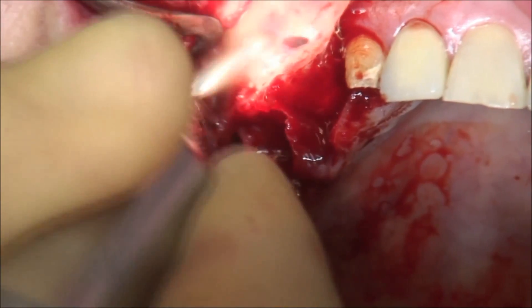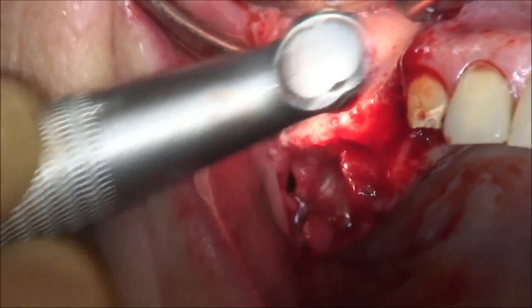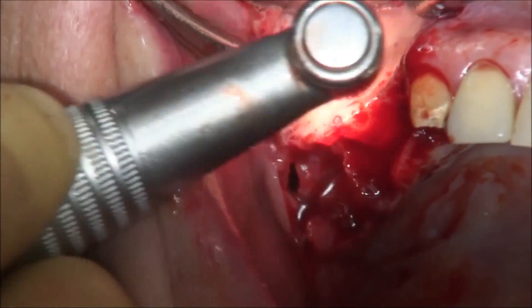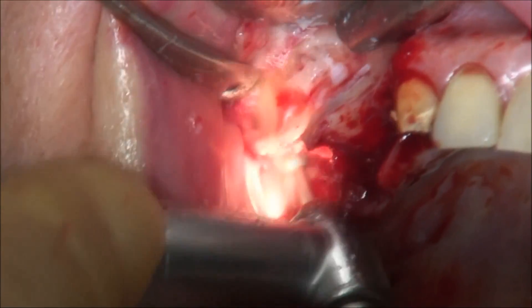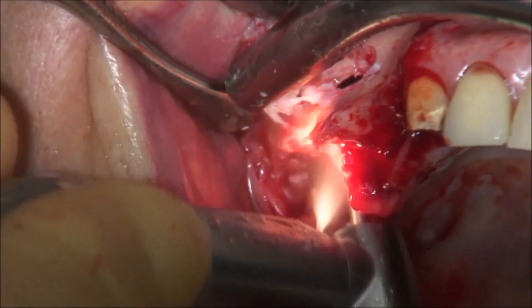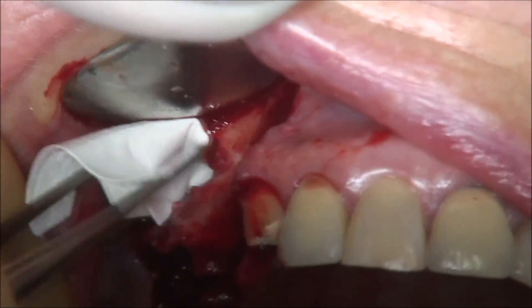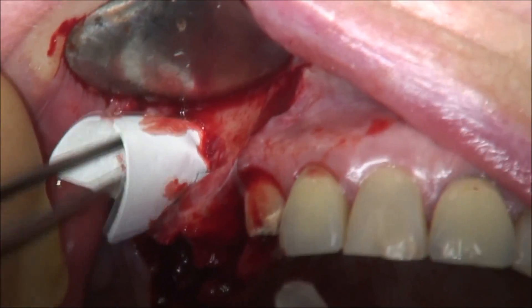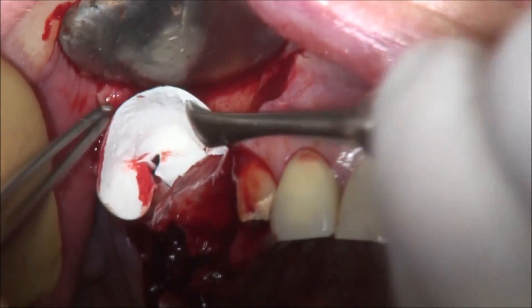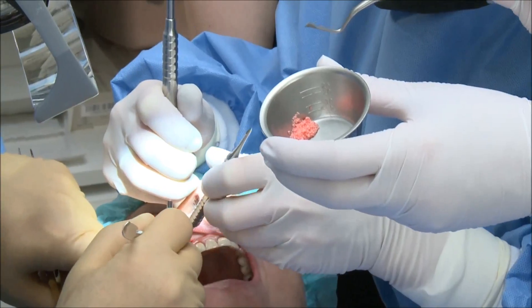We use a 3 mm red grid diamond burr to open the lateral window. After creating enough space, as we can see here, there is a rupture of the Schneiderian membrane due to previous surgeries and infection. We introduce a collagen membrane — smooth surface to the top, rough surface to the bottom — in order to repair the rupture of the Schneiderian membrane, creating the new space and new cavity.